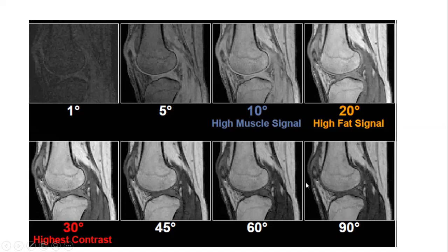Though we still have some appreciable contrast in all these other two, the greatest amount of contrast is about here. Of course, this is the worst. 1 degree.